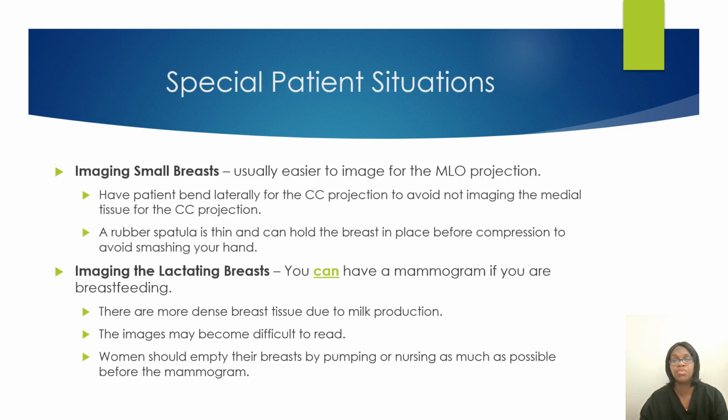Whenever you have to image someone with very small breasts, make sure that you get the smallest breast paddle that you can use. You can also use a rubber spatula. So, textbook wise, you think this is probably funny hearing that, hey, I can use a spatula in mammo. There are spatulas. Most clinics or all facilities should have a thin spatula. And whenever you have a patient with small breast tissue, this is very helpful whenever you are imaging, because when you're coming down with that compression paddle, you will not hit your hand or your fingers because you have the spatula that will be in the way.